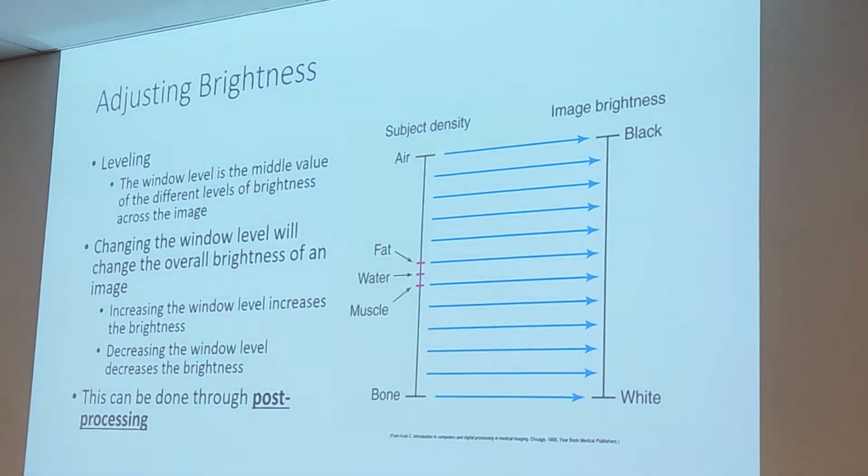But now we can change it. The process of changing the brightness deals with the window level. So brightness is about leveling.